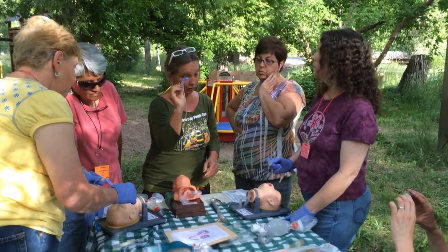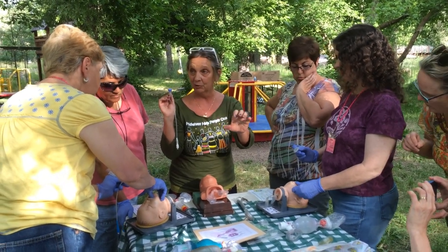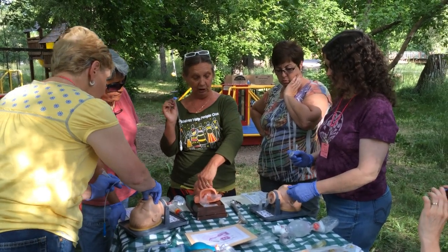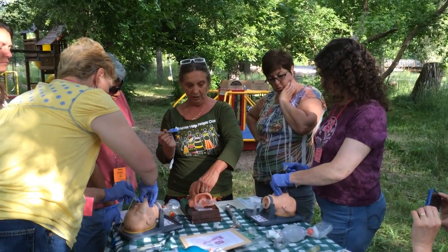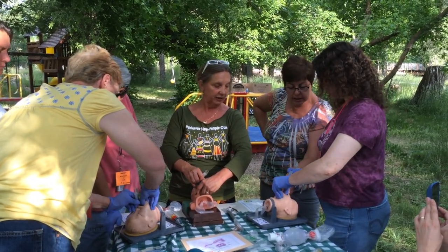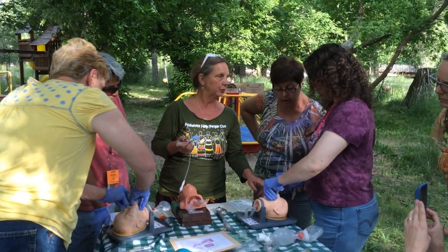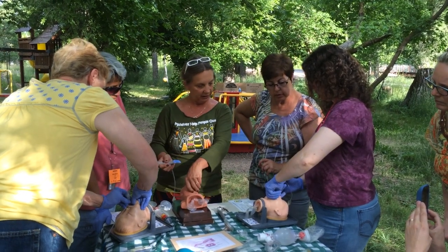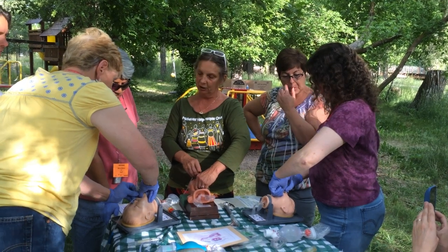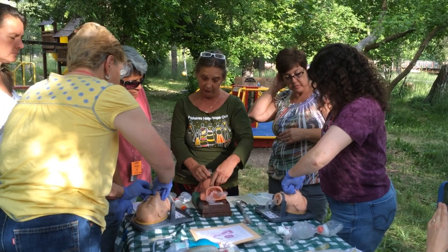So you're going to do with the thumb of your non-dominant hand the exact same thing you did with the laryngoscope, which is hold the tongue up and out of the way, and then make some space in there for you to get your LMA in next to it. Go all the way to the back of the baby's tongue and hold the baby's tongue up and out of the way, and then force your LMA in next to your thumb until you can't force it any further. And you really want to force it in there.